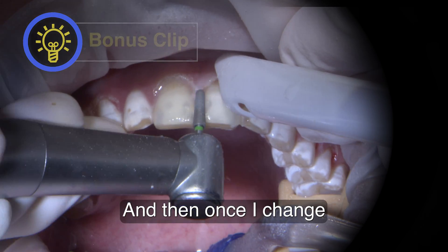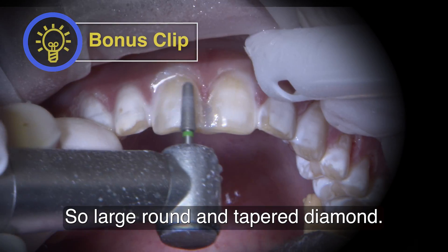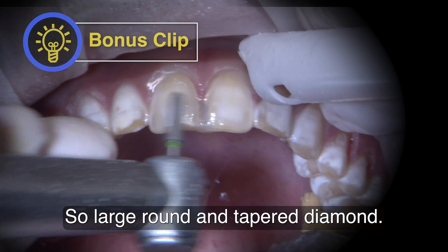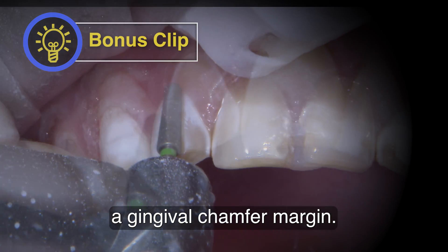And then once I change the gingival architecture, we're going to prep through. Large round-end tapered diamond — I'm really just trying to establish a gingival chamfered margin.